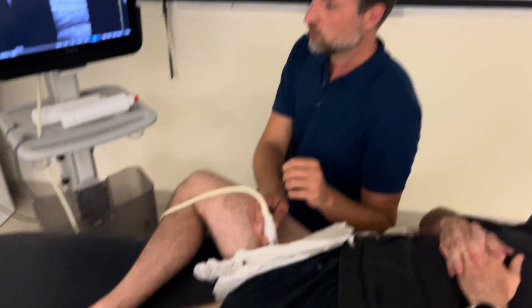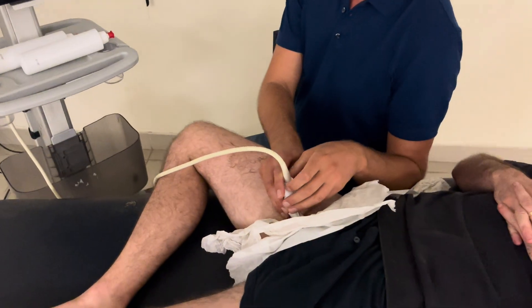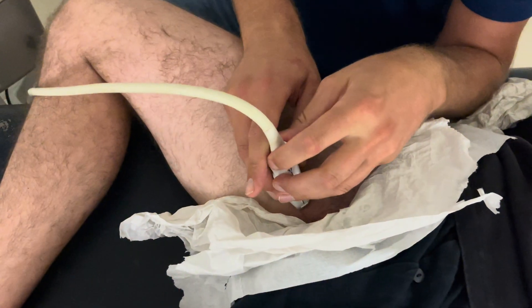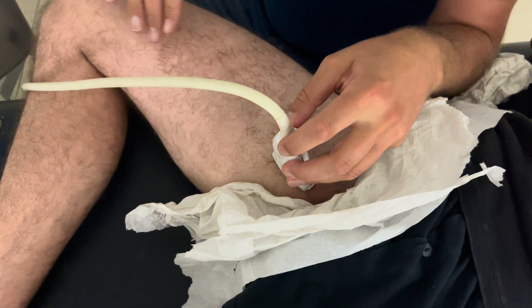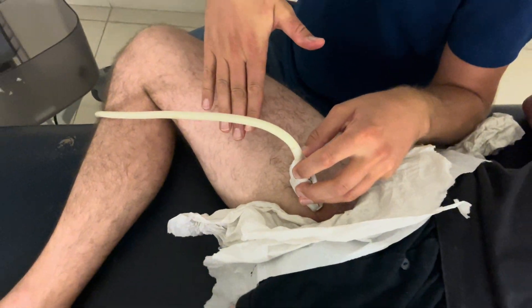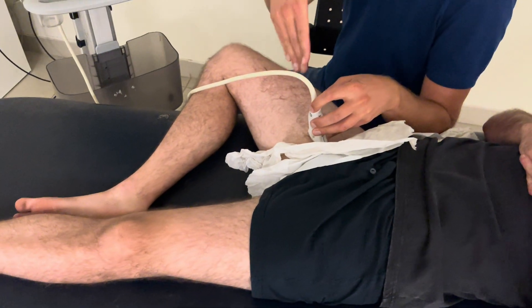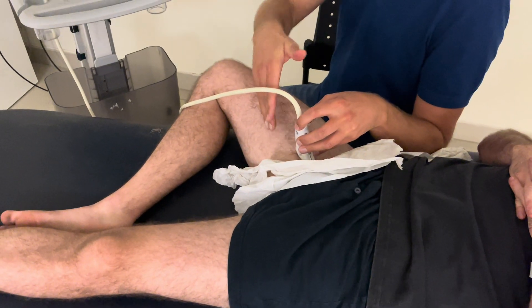For the adductors, we're going to start here on the muscle belly. The patient is positioned in this way — you have to do that because otherwise your probe cannot get in between.